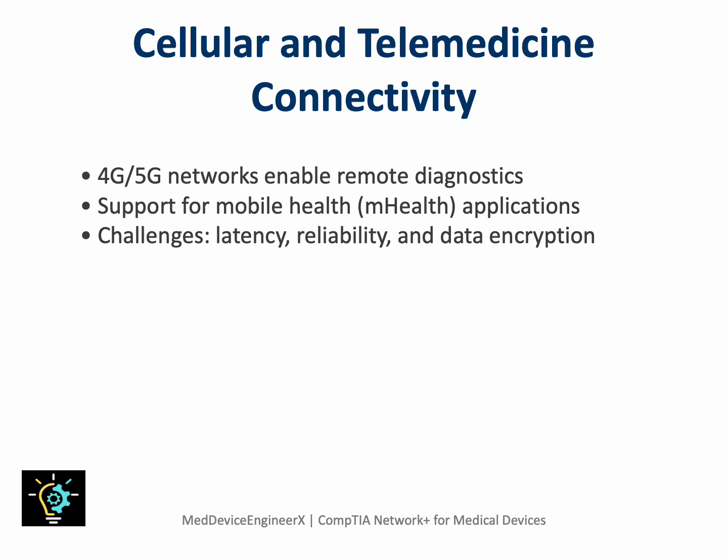However, reliability and data privacy remain challenges. For example, coverage gaps and variable signal strength can impact performance. Encryption and VPN tunneling are used to secure transmissions. As healthcare expands beyond hospital walls, cellular networks bridge the gap, connecting ambulances, clinics, and patient homes into a unified digital care ecosystem.